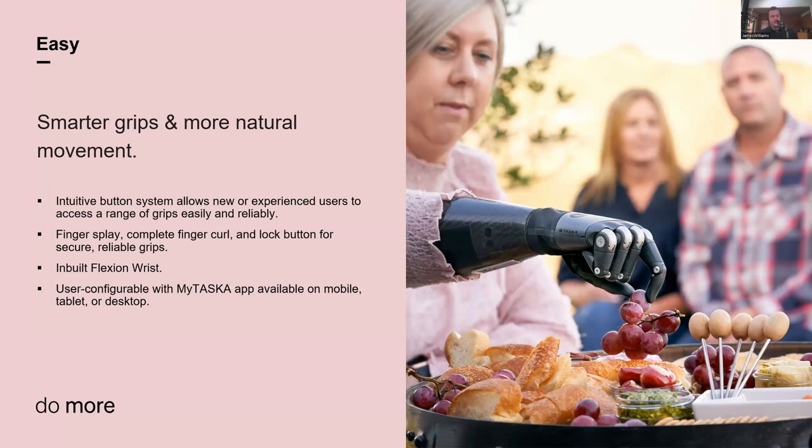There's a flexion wrist built into every model. For instance, if I'm going to use a fork and the table height or angle makes it difficult, I can just adjust the flexion of the hand and reposition it to make it easier to use. Flexion wrists are fantastic, especially for people with long residual limbs. We've got that in our low profile model too — it's not a compromise you have to make. Every hand comes with that built-in flexion wrist.